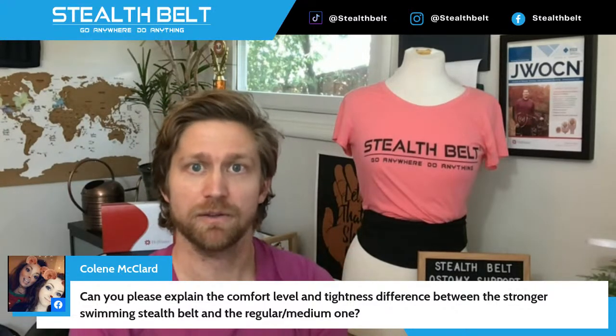Viewer question about the difference between the regular Stealth Belt and the neoprene/swimming one. The two products are the Stealth Belt Pro — the main flagship product, what's on the mannequin here — which nine times out of ten is the best option for someone new to Stealth Belt. The water-specific belt is the neoprene belt. As the name suggests, it's made out of neoprene, like a diving wetsuit, and it's a lot thicker — about three millimeters thick.